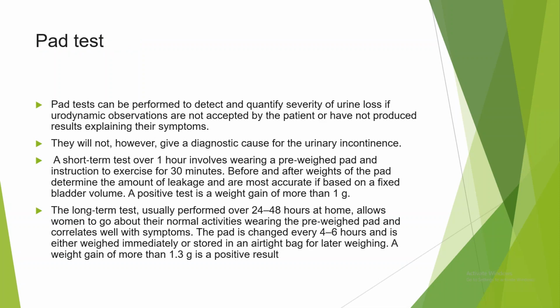They have mentioned the pad test in detail in the talk. I don't know why, but just for completion, I'm telling it can be a short-term test or a long-term test. The short-term test is done in the clinic. The patient is given a pre-weighed pad and asked to exercise for 30 minutes. Before and after exercise, the pad is weighed. If the gain is more than 1 gram, it is known as a positive pad test. And the long-term test is usually done at home over 24 to 48 hours.